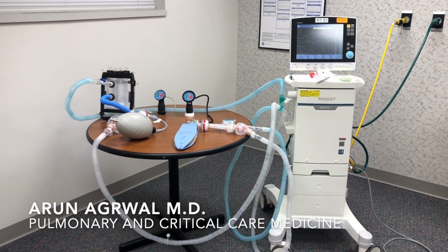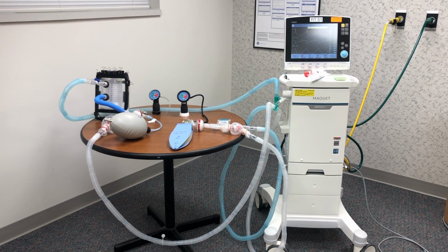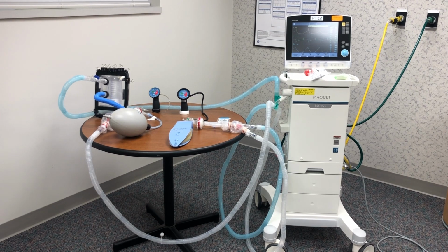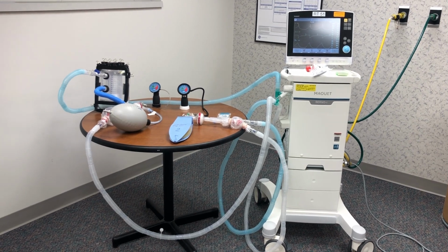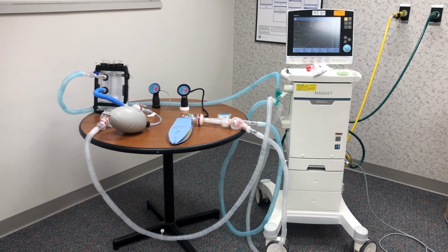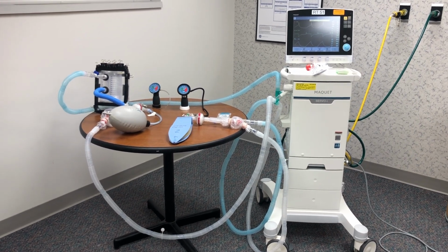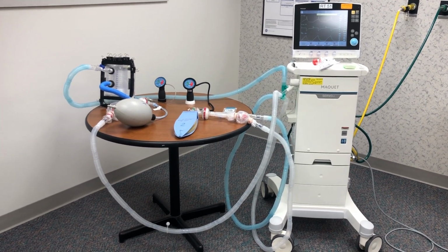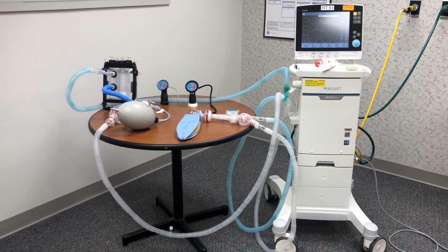Hi, this is Arun Agrawal from Pulmonary and Critical Care, and what you are seeing here is a working prototype of how to ventilate multiple patients with a single vent, and basically we will just call it multi-vent at this time. And if you see here, this is a ventilator which is set up in pressure control mode, and we are ventilating 2 patients. The key thing here is that you can control individual pressure or volume or PEEP, and even find out auto PEEP in individual patient.